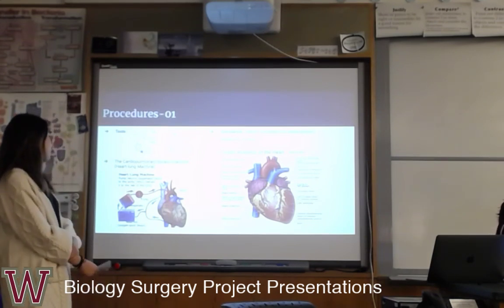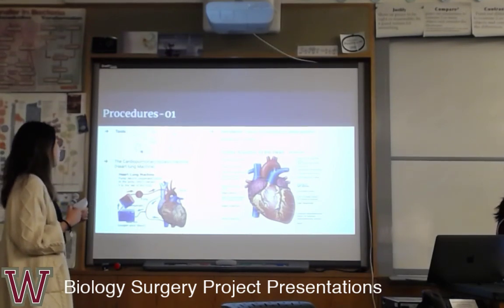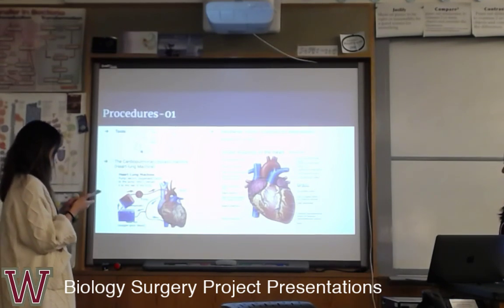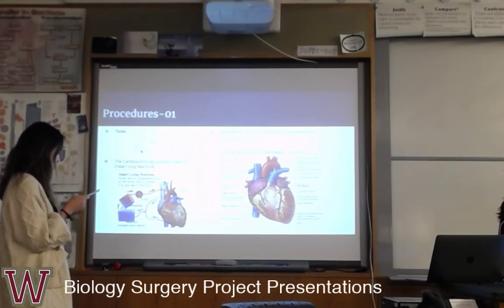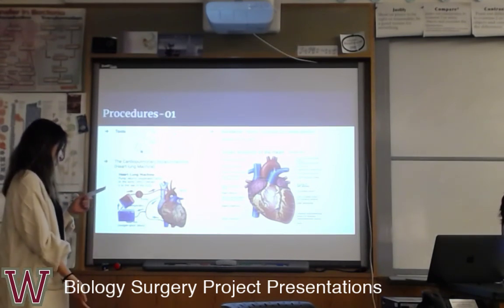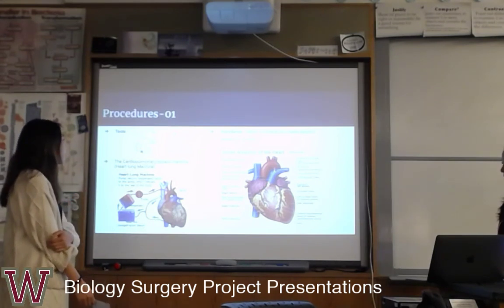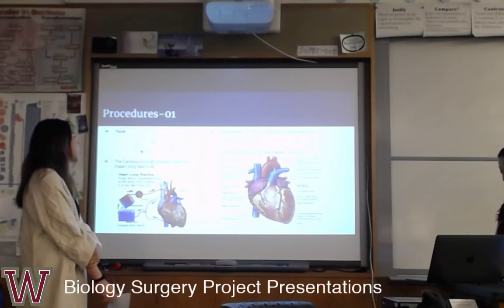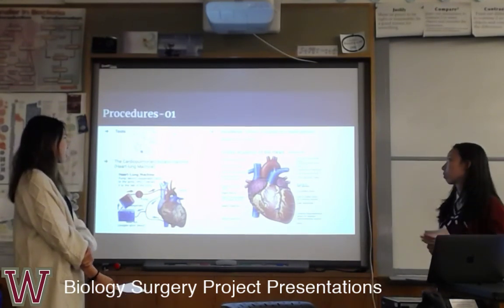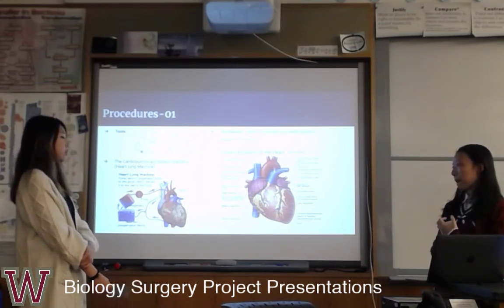Here are the procedures, and I'm going to introduce the tools we're going to use in the surgery, like graspers, needles, needle drivers, and retractors, and also cutters like scalpels, scissors, and surgical scissors. And we're also going to use anesthesia. General anesthesia is what causes people's insensitivity to pain.